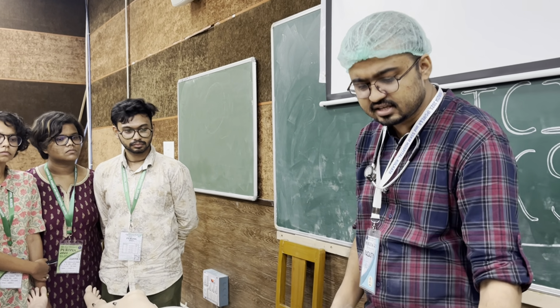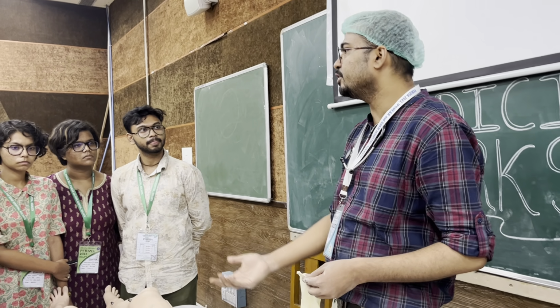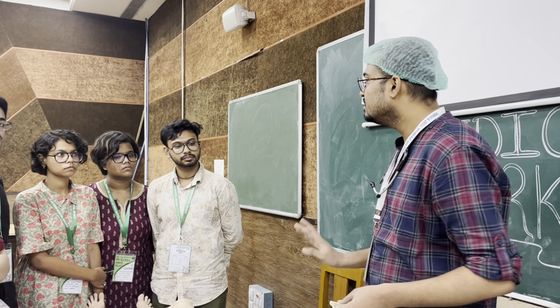Another is in case of intestinal obstruction or any abdominal pathology, before surgery or after surgery, to take out the intestinal contents, we can use the nasogastric tube.